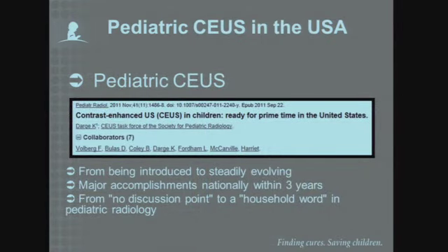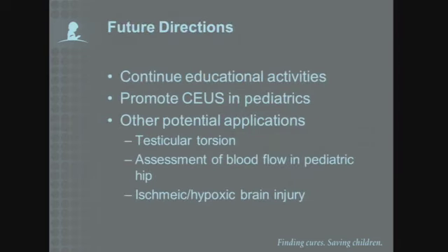So we are making a lot of progress just within the past 3 years. We've had some major accomplishments in education, and the use of contrast ultrasound is continually expanding in the United States. We will continue our educational activities.